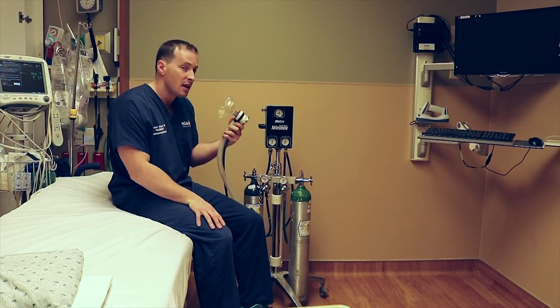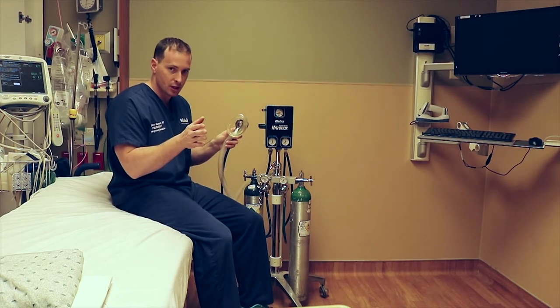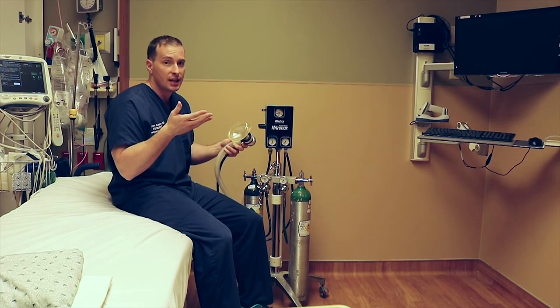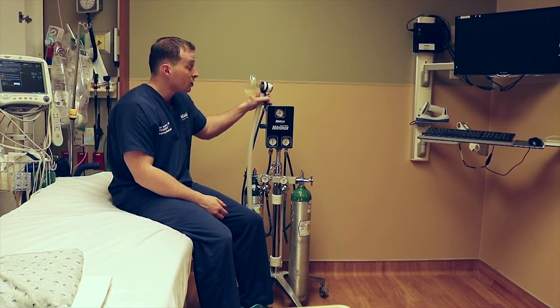This demand valve mask only works when the patient is taking a breath in themselves — it's not flowing naturally. They have to take a breath of about 3 to 5 negative millimeters of water pressure.